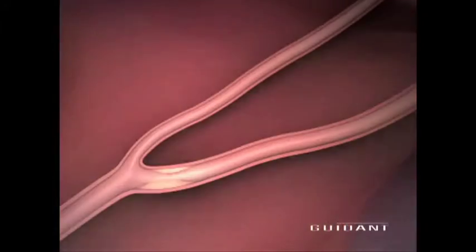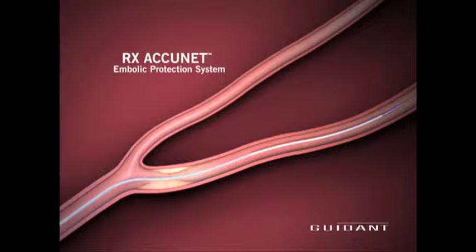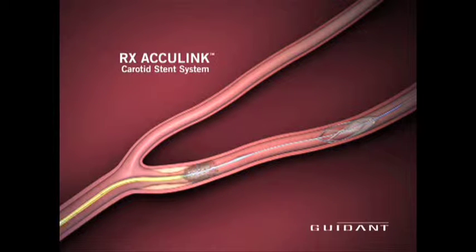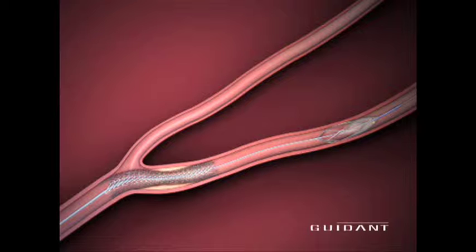Carotid stenting is a procedure where we remotely place a stent, let's say from the groin artery all the way up into the neck artery, and trap the debris and prevent it from going into the brain. It's an equally effective technique, but it has some risks to it. Let's turn to Dr. Voice. Has carotid stenting met its potential, and has it come to equal the efficacy of traditional carotid endarterectomy?